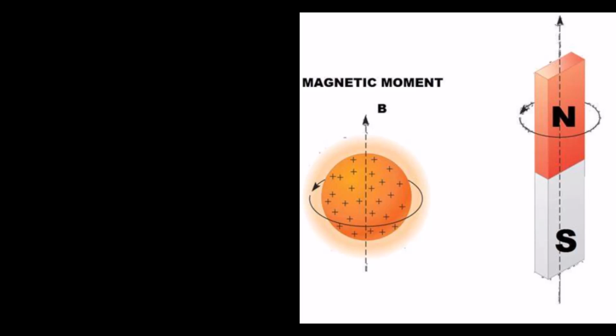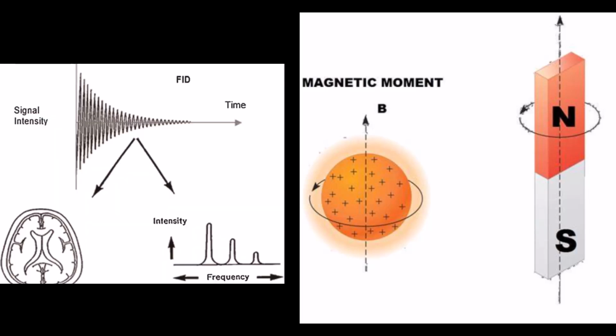During this realignment, they give off energy, or they have energy decay, until they have less energy and can be realigned with the north. We document this decay or energy loss in frequency as the protons realign to the north. They are losing energy as they realign, and this is called free induction decay, FID.